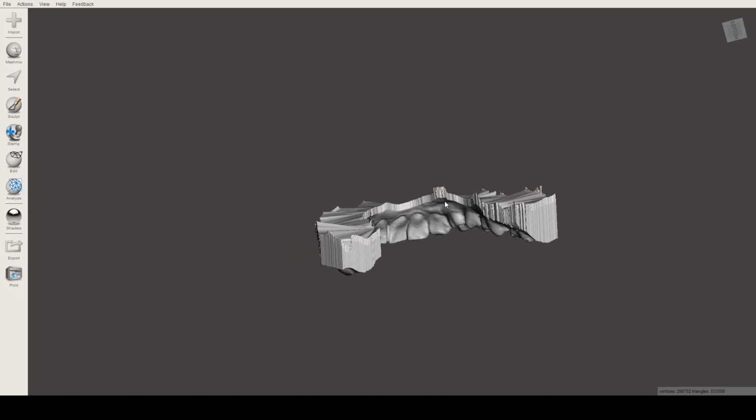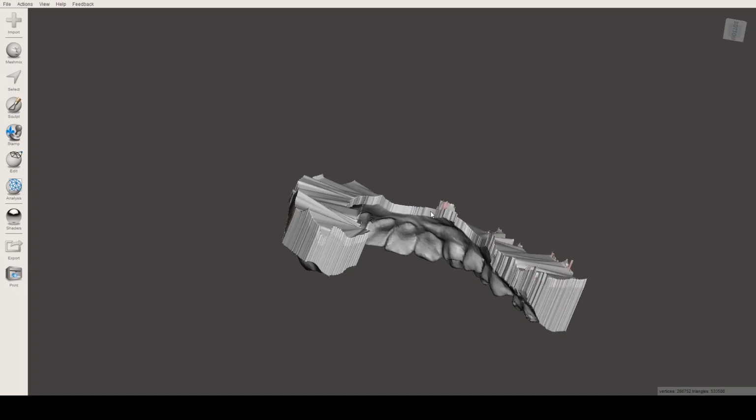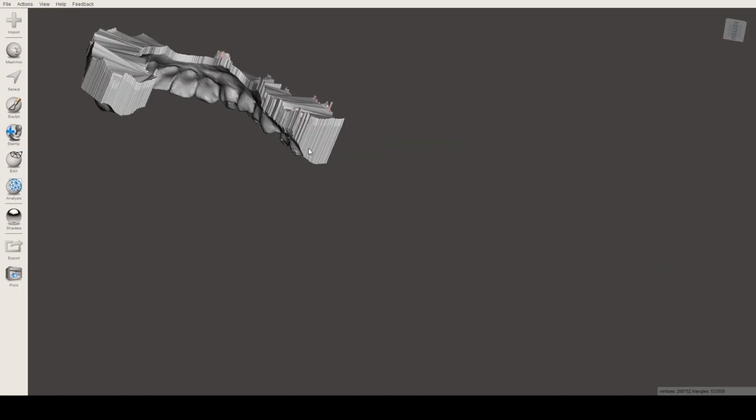If you have a mouse, it's better to use a mouse for manipulating 3D objects, because it gives you the amount of freedom to move it around, and it gives you more options than you have with your trackpad. For example, zooming in and zooming out, you just use the scroll button of your mouse, or you can also scroll click, which moves the model around your working area or your workspace.